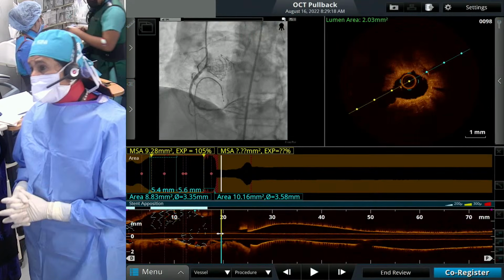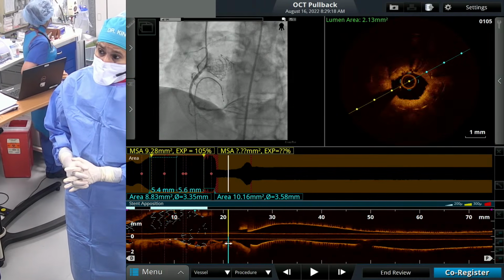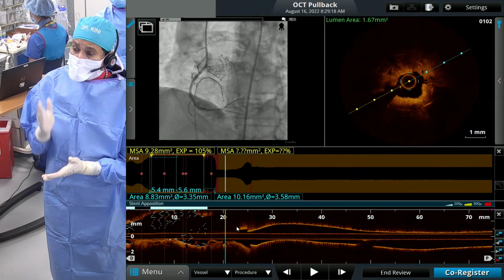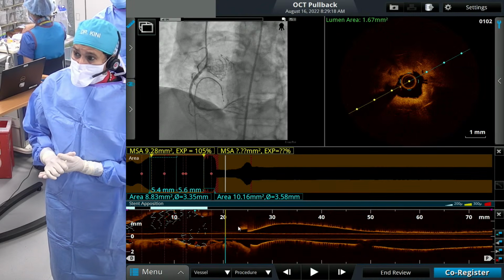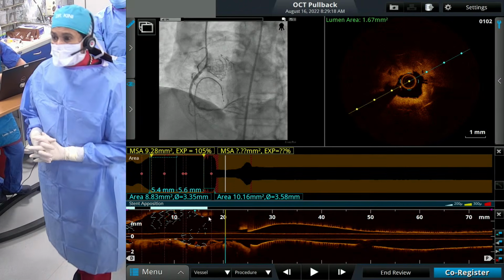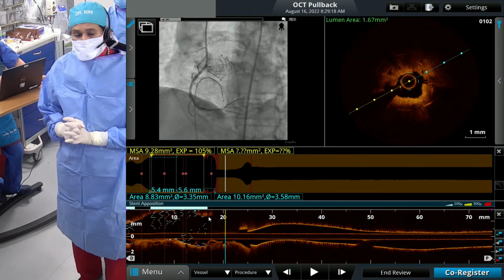So once we have disrupted the intimal hyperplasia, why is this important? When you have thick intimal hyperplasia, sometimes expansion of the stent could be harder. That is why you need to disrupt it. Then you go with a high pressure balloon like we did here. We knew the stent expanded, and then you restent it, knowing that there was some lipid or new intimal hyperplasia, or making sure that you are scaffolding the aorto-ostial lesion again with another layer of stent.